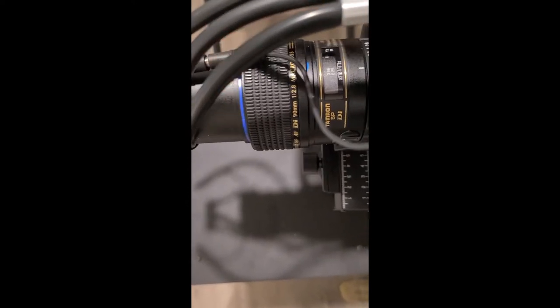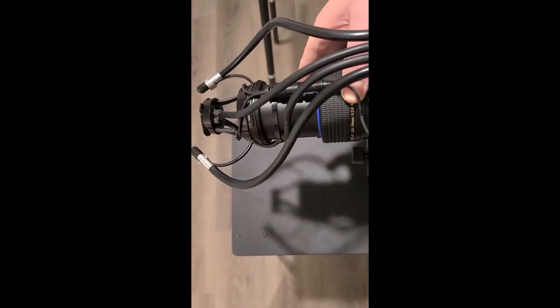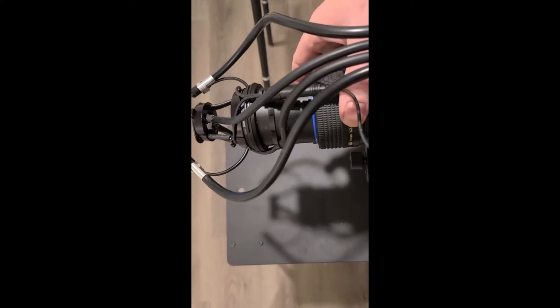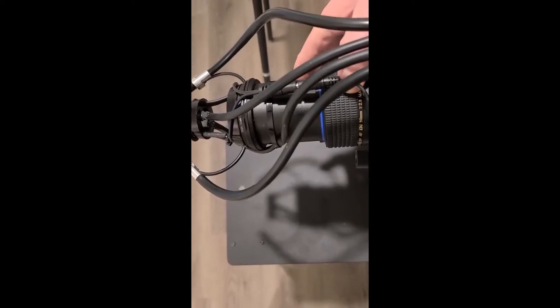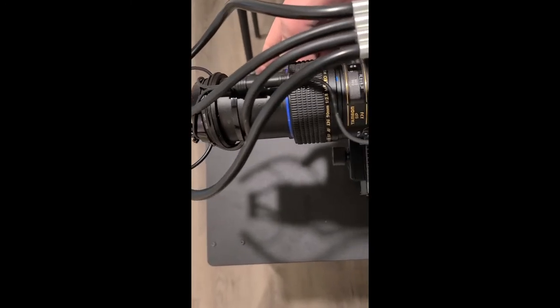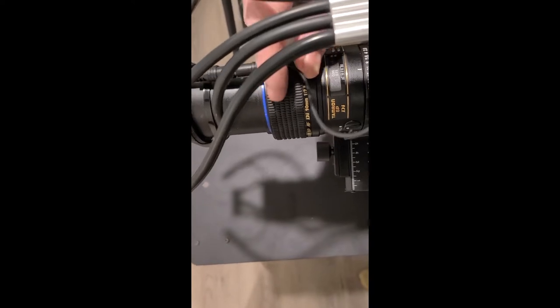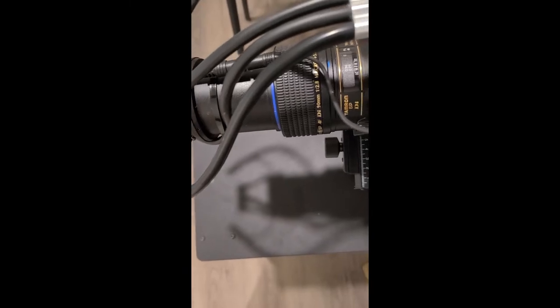You can see the blue collar out here, and when you do that you can see that the lens moves in and out. What you're going to do is push it so it's all the way out — you can hear there's a little stop right there. This is the setting you're going to have the lens at in order to take the iridology images.